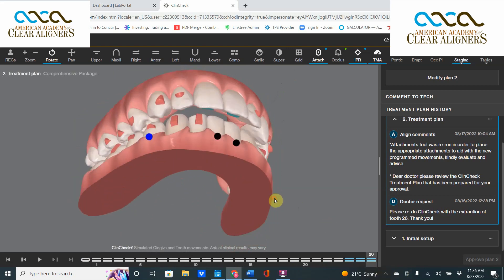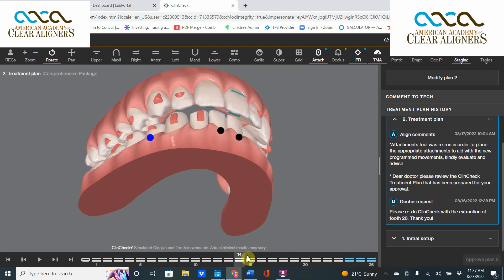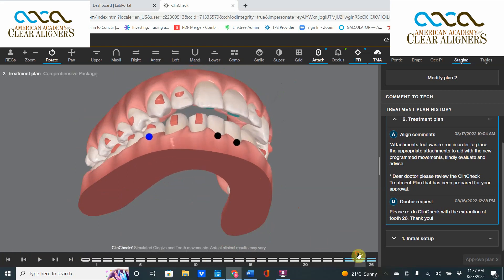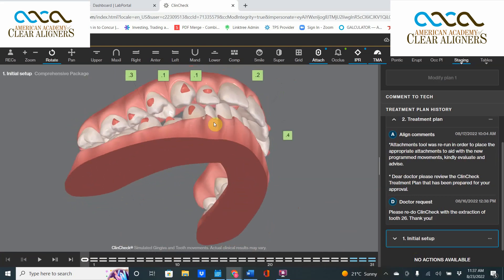Look what happens in this case to the end-stage overjet. You can't end with an overjet like that. You could end with that overjet if you started with a big overjet, but if you started with a normal overjet or anterior coupling, you cannot put a patient into that type of occlusion — they won't feel their teeth touching, they won't be able to bite into a sandwich.